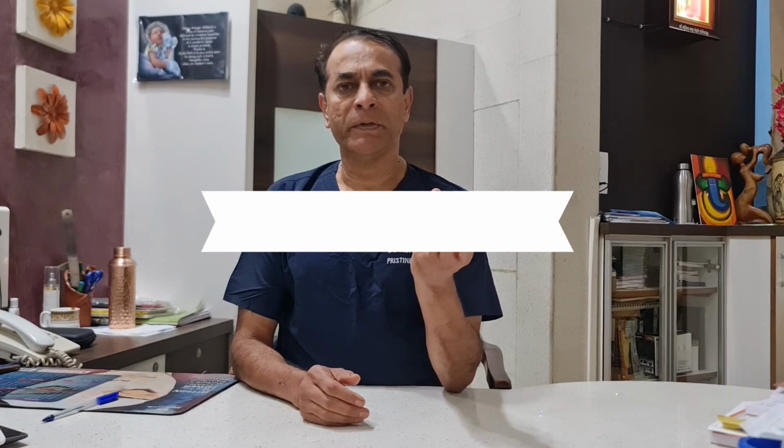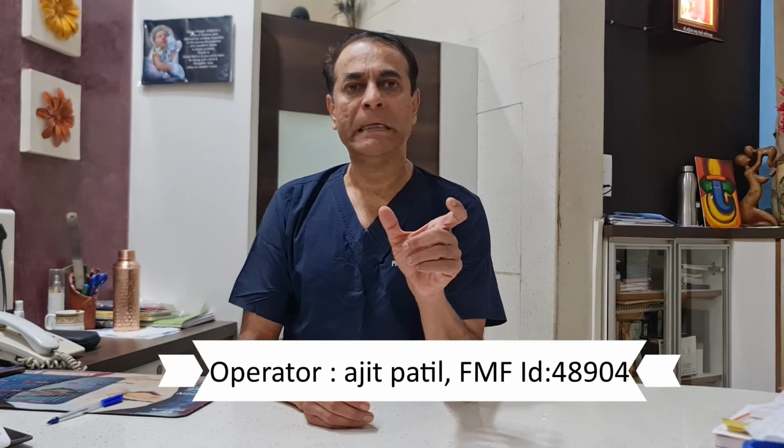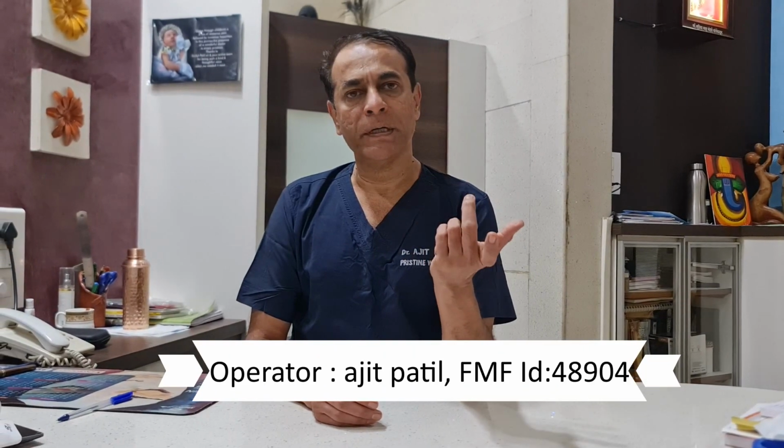However, there are certain requisites for doing an NT scan. Number one, the sonographer should be trained appropriately by the Fetal Medicine Foundation. When you go through their online course and submit your set of images, they will certify you and you get a number, sort of a license number, and that tells you that your ultrasounds are accredited by Fetal Medicine Foundation. Then certain measurements that we take go into a software, which is again provided by the Fetal Medicine Foundation, and this software will calculate the risk associated with this pregnancy, like what is the risk of this baby having Down syndrome, etc.